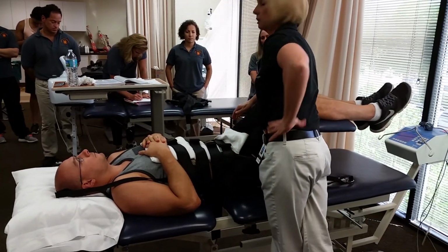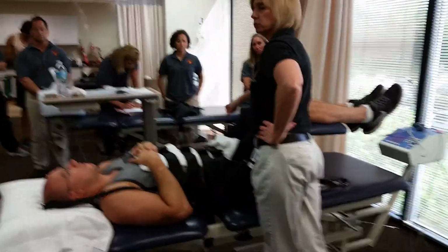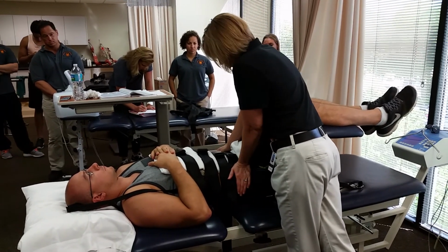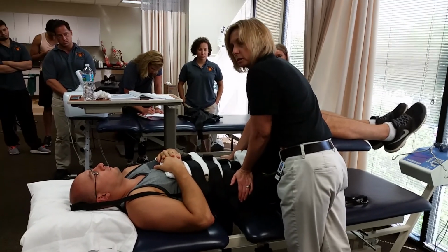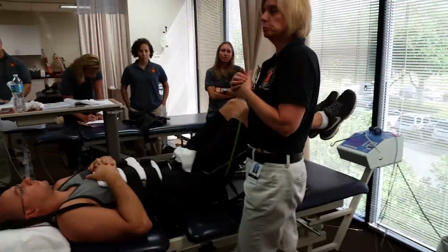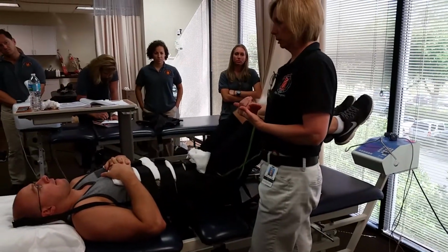Once we loosen up, we just give it a second for circulation to adjust, because remember we provided a compression through the abdomen. Okay. Then you want to just make sure you very gently kind of rock the pelvis a little bit, and that's so things adjust. You've separated things. You want things to kind of adjust back in position before you start moving them and add weight to the spine. Okay.